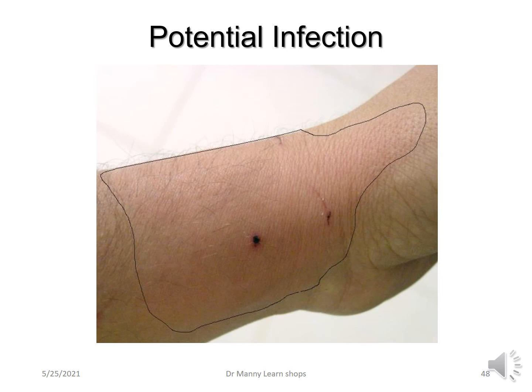Another one is always potential infection. All invasive lines that breach the skin carry the risk of infection.